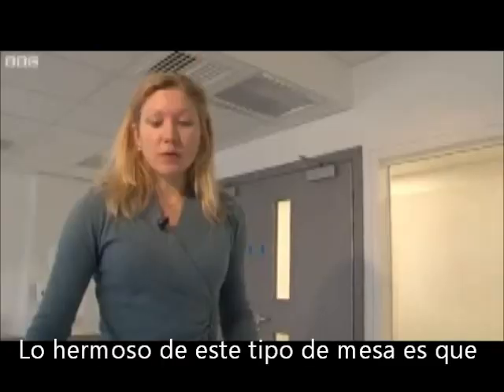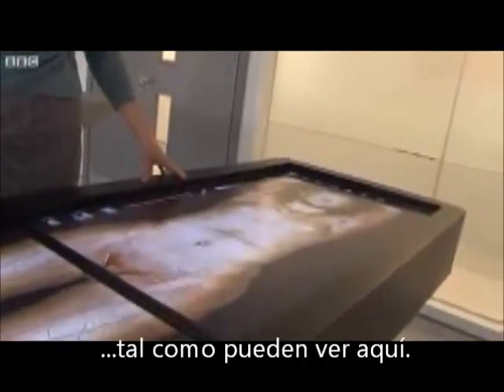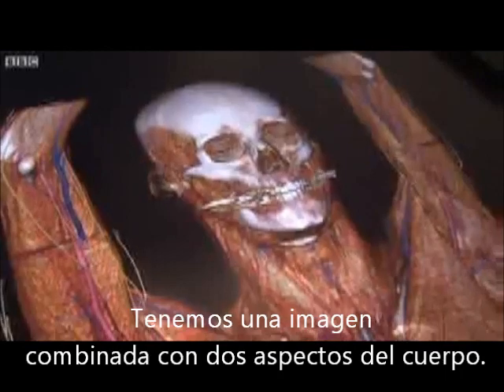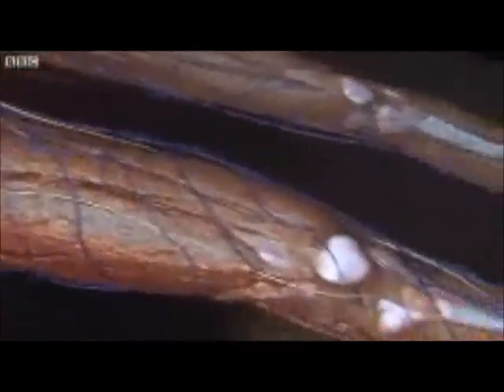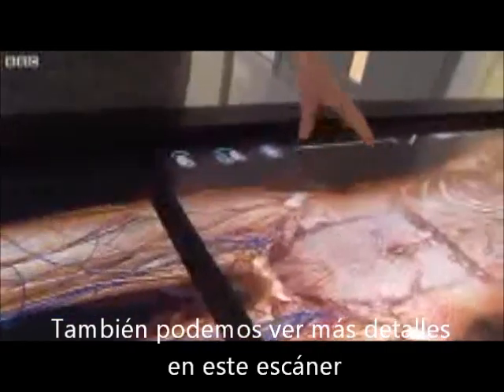The beauty of this table is that it allows us to peel away layer by layer and to explore the anatomy, which is what I'm going to do now. So you can see here that we have an image with two combined aspects. One is these cartoon-style segmented vessels, blood vessels here, which form a simplified image for us. And also we've got the more detailed CT data associated with that.